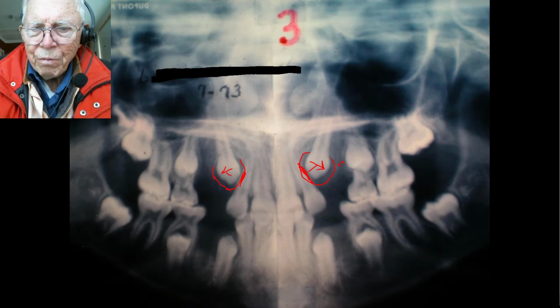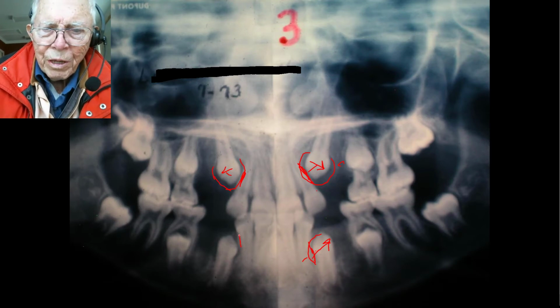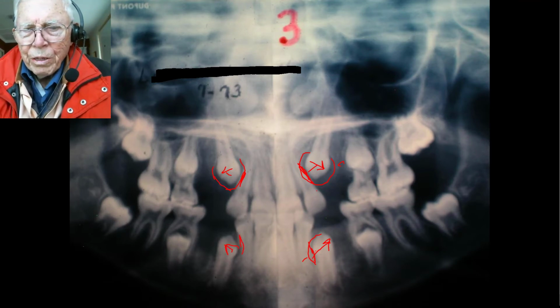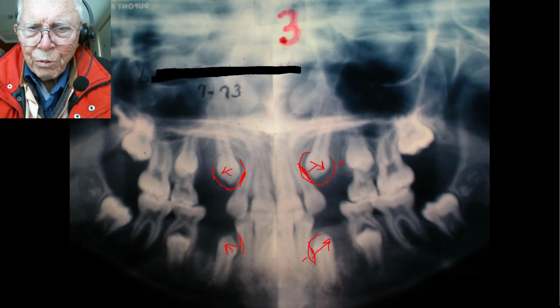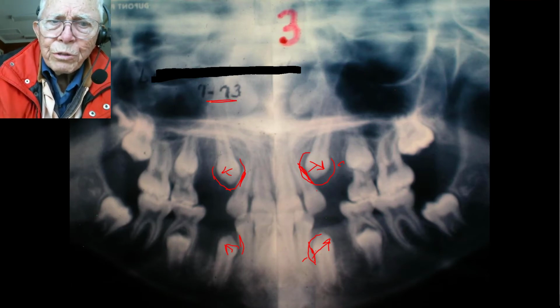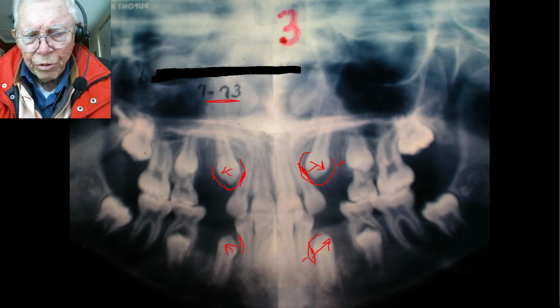These teeth that were way over underneath here have already, see the follicle flattened out right here and is shoving them over in this direction. It flattens out, shoves us in this direction. Now this is important, so you're going to watch these teeth come in. This is only 2 months after we took the other teeth out.